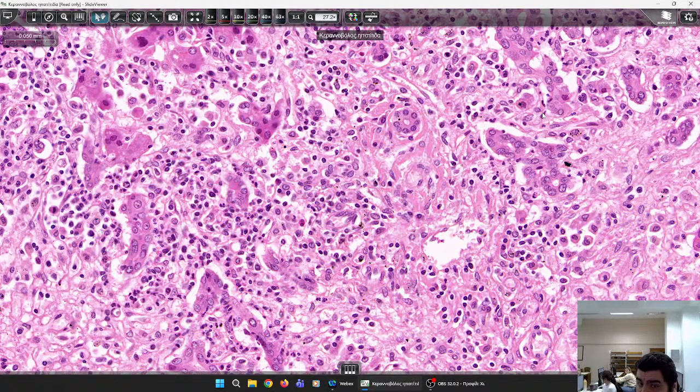If it would be autoimmune, what is the hallmark of autoimmune hepatitis in histology? Plasma cells. When you see big groups of plasma cells, you have to think of it, but still, they don't wait for you, because it would be a woman, middle-aged, with a very high IgG. The clinical context will be very clear in such cases.